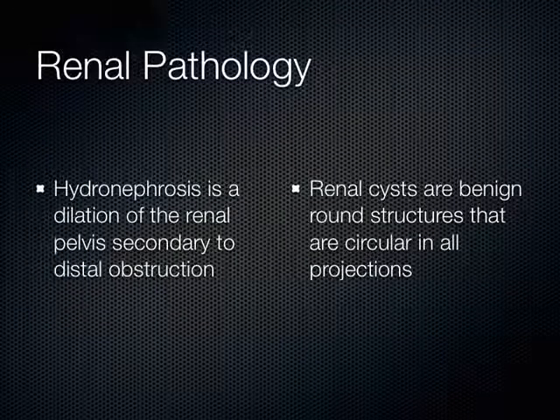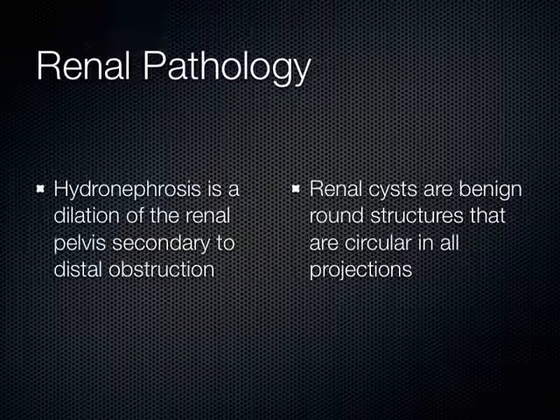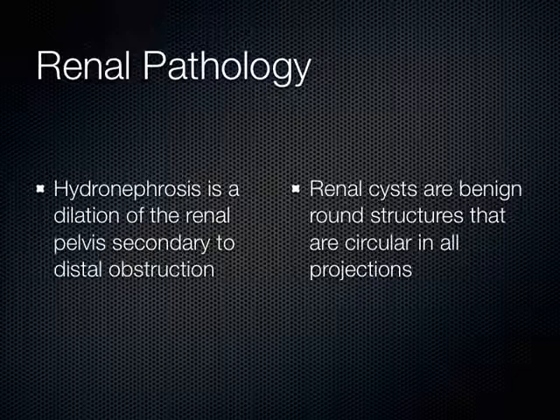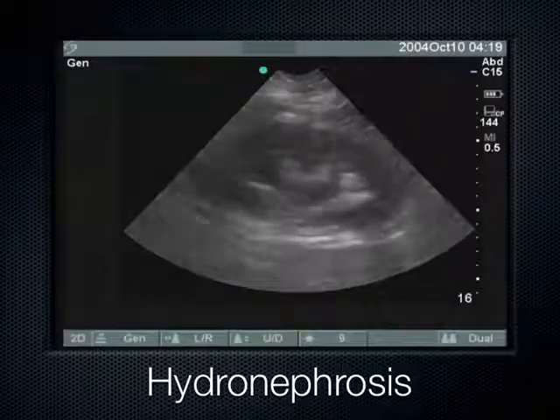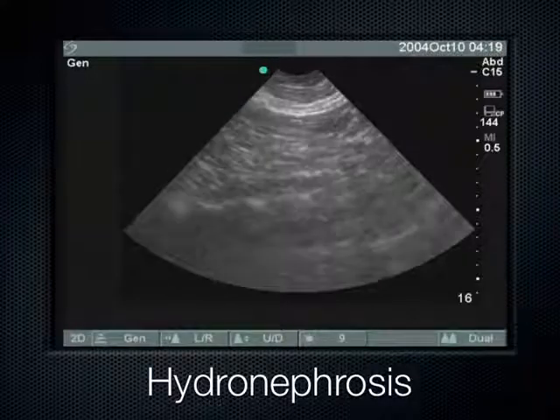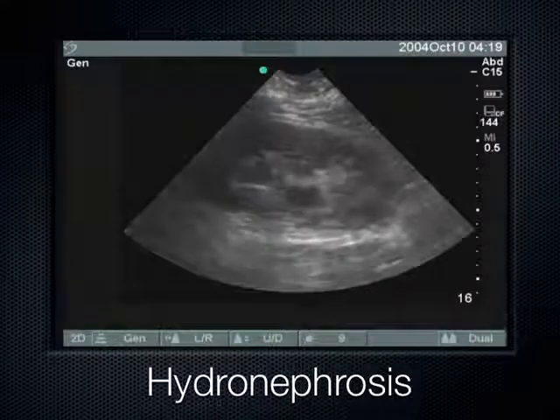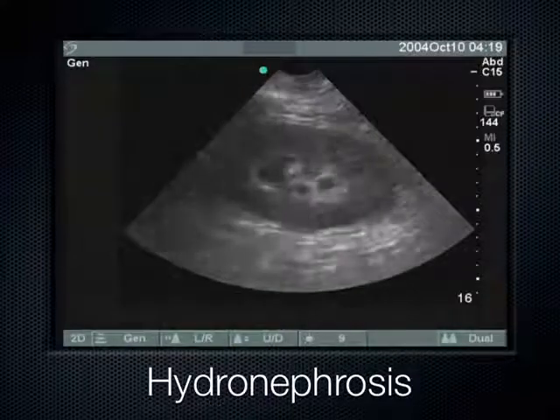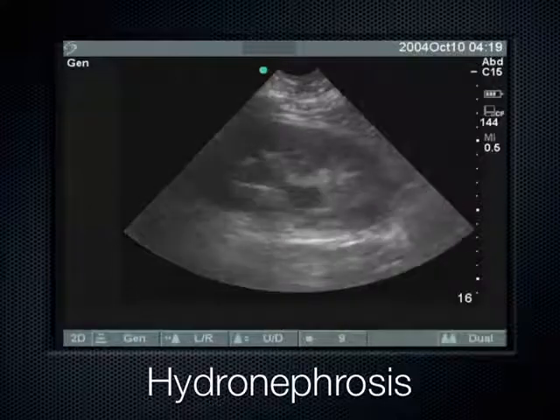When looking at a kidney we break it into whether we see something out in the cortex or in the collecting system — also called the renal pelvis or renal sinus. If something in the cortex is anechoic and spherical in all dimensions, it's a renal cyst. But if you see anechoic fluid in the center or pelvis of the kidney, that's hydronephrosis — fluid building up. This is what mild hydronephrosis looks like: a glove-like formation splaying out in the center, the pelvis with fingers extending toward the cortex.